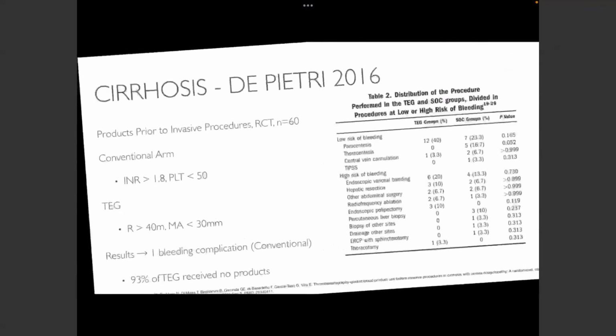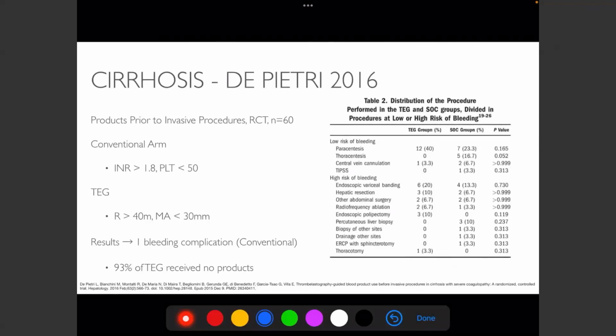Can I just ask a question about that? Was that guiding transfusion therapy during the surgery or pre-op? Intra-op, pre, post, and intra-op. Okay. Obviously the surgeons were already on board with using Rotems to be able to do the study, otherwise they never would have gotten IRB approval, but it was basically the whole hospitalization, up to 30 days, I want to say. The reason they were able to do that is because surgeons have long used Rotem over INR.